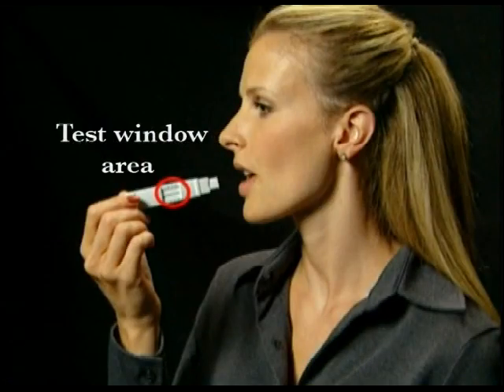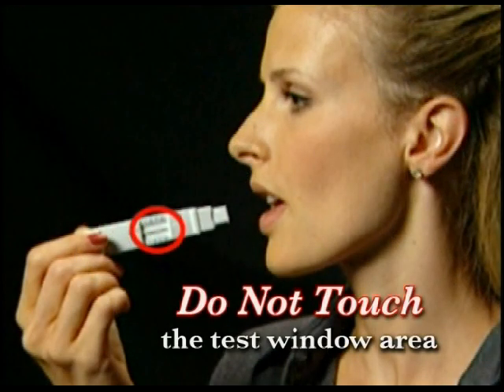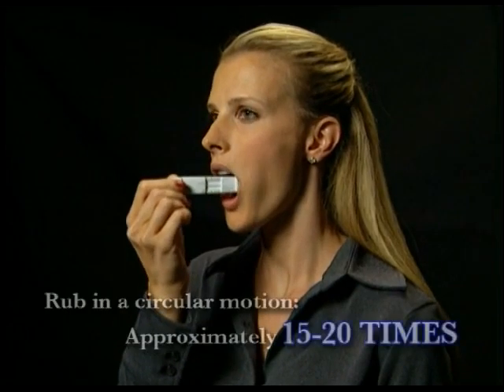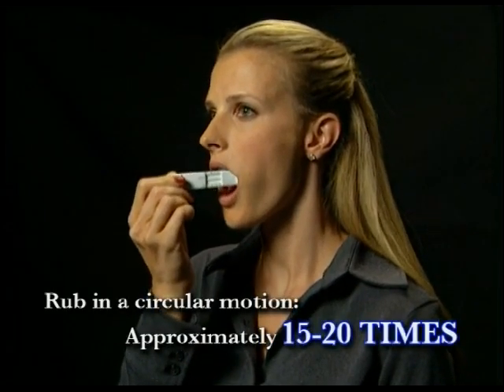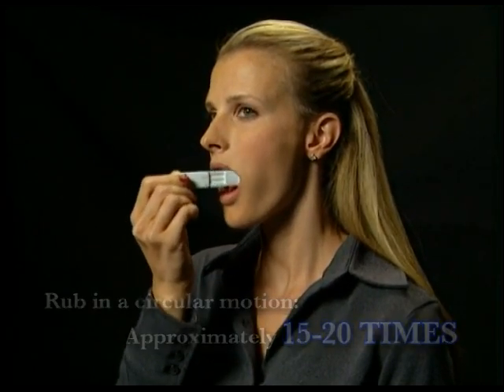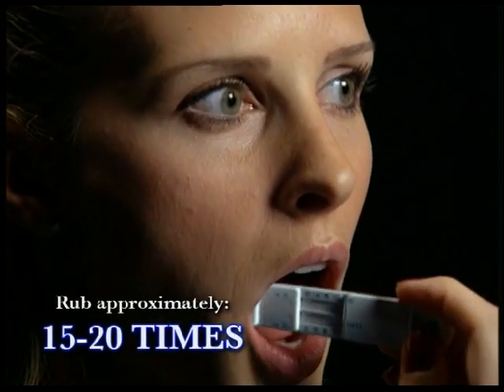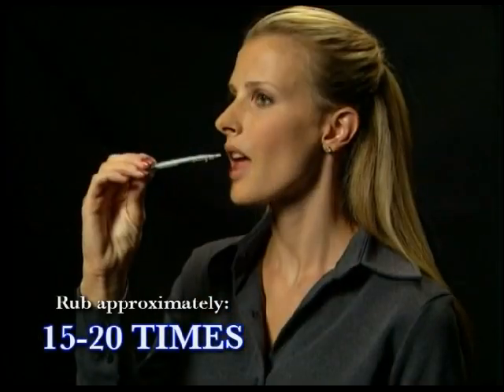Instruct the donor to hold the top portion of the device above the two windows. He or she should not touch the test window area. Advise the donor to keep their head level when placing the device into their mouth. Instruct the donor to keep the top of the collection pad facing the inside cheek and gently rub several times in a circular motion. Now instruct the donor to turn the pad and rub several times on the opposite cheek, still keeping their head level.